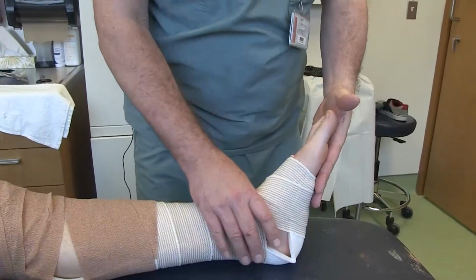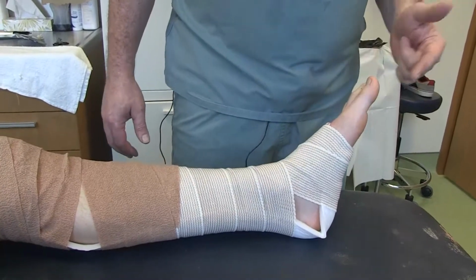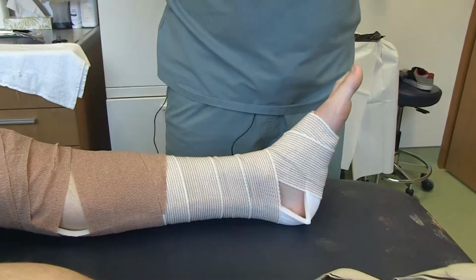Once the brace is hardened, like it is the case here, we can keep it in the future because it'll work as long as the child does not grow too much.